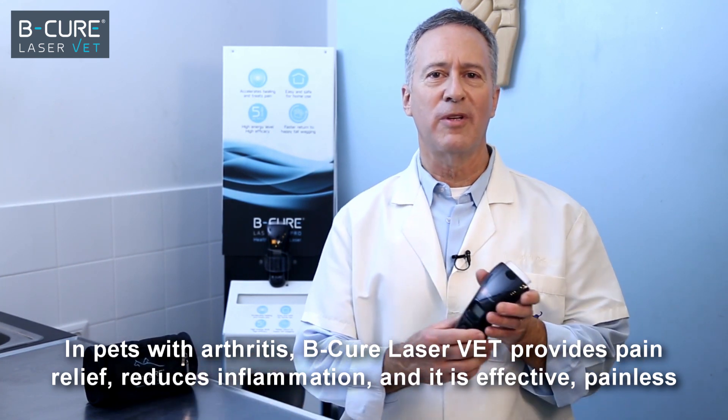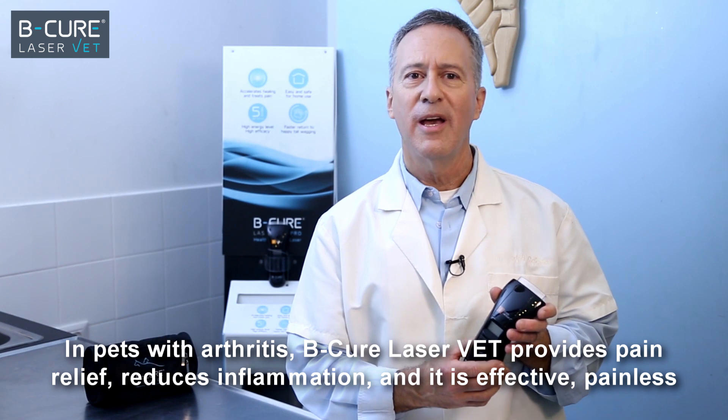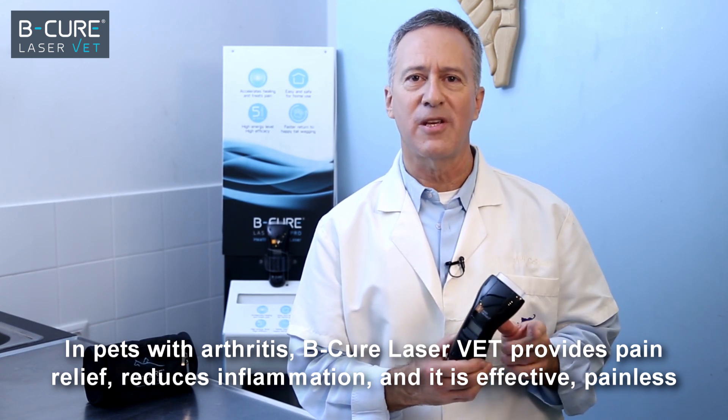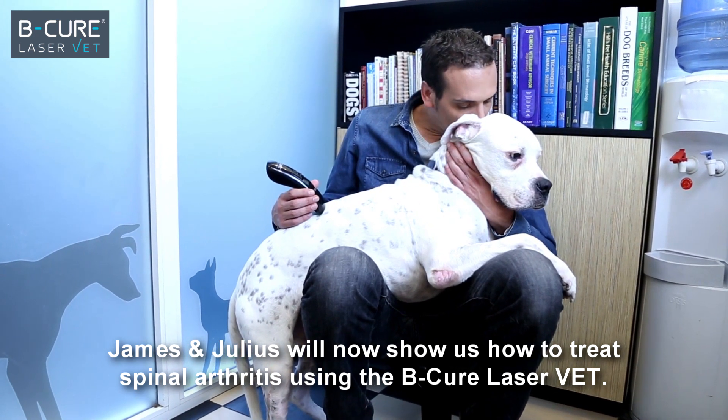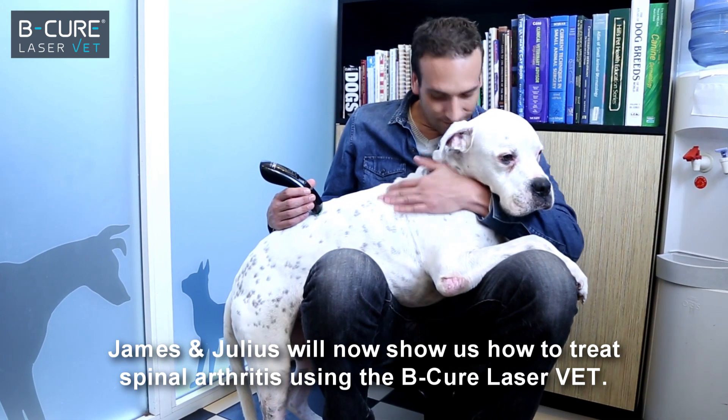In pets with arthritis, B-Cure LaserVet provides pain relief, reduces inflammation, and it is effective, painless, and very well tolerated. James and Julius will now show us how to treat spinal arthritis using the B-Cure LaserVet.